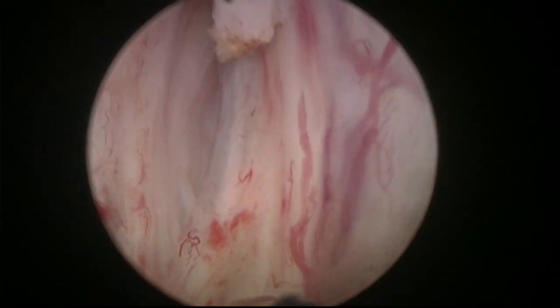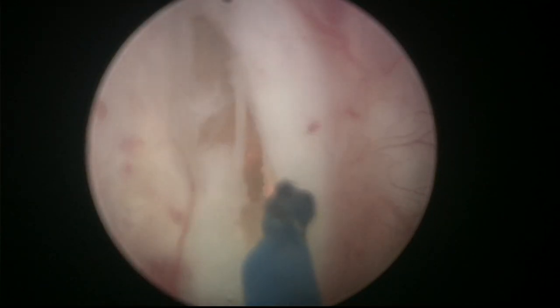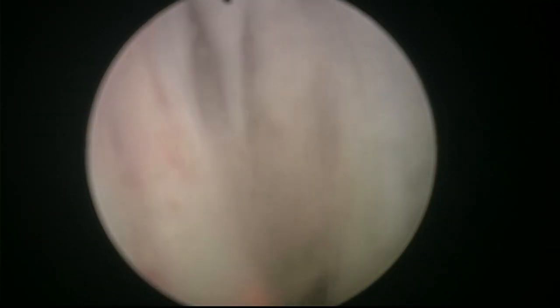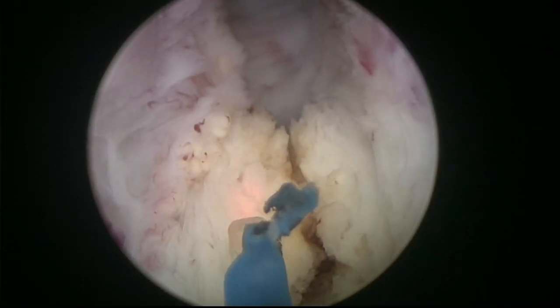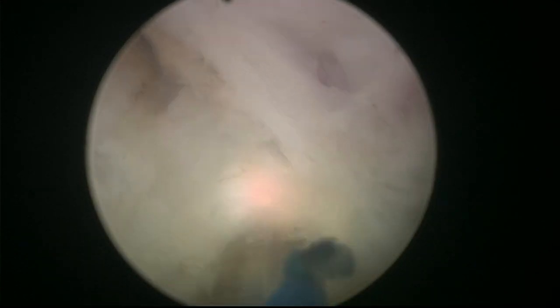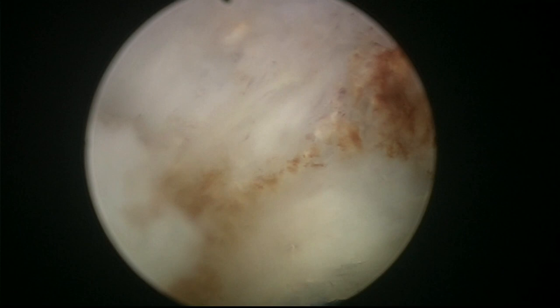From here to here it's a very short way, so it makes life much easier if we can do the incision in two parts. Let's come up here, try to get inside the incision, and bring it down to connect here. There will be a point where we find the plane that we developed near the verum montanum — which is around here. This is capsule. We'll bring the incision upwards to the depth of the capsule — that's a way for someone without much experience to know where the limit of the capsule is.